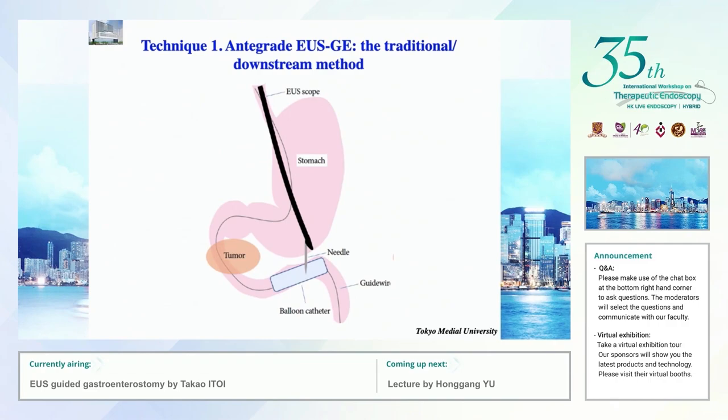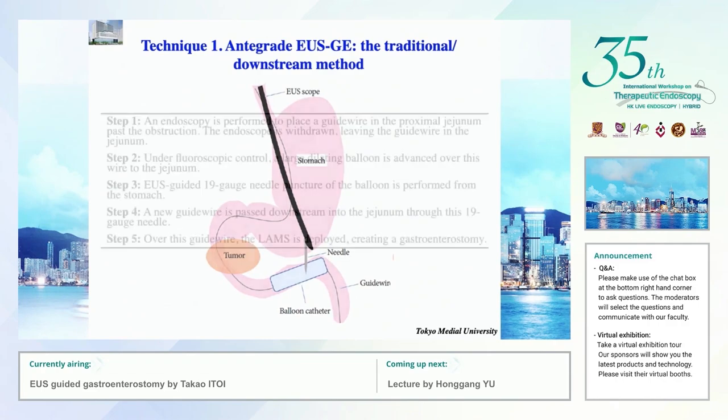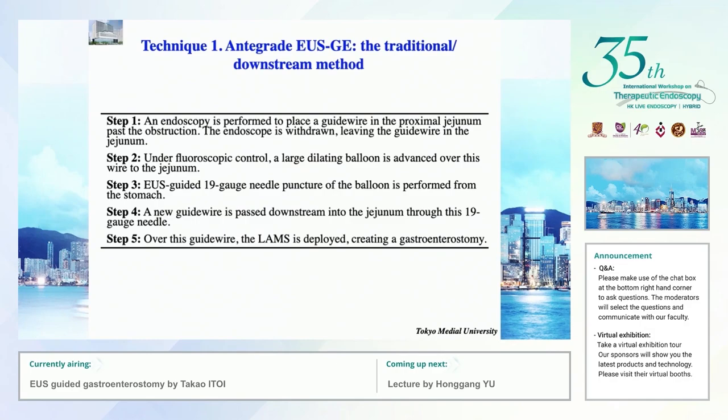First, traditional downstream method. Step 1, an endoscope is performed to place a guide wire in the proximal jejunum past the obstruction. The endoscope is withdrawn, leaving the guide wire in the jejunum. Step 2, under fluoroscopic control, a large dilating balloon is advanced over this wire to the jejunum.